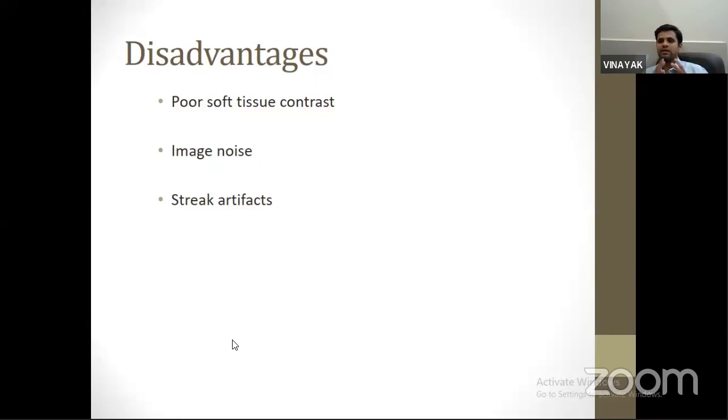But when the lesion is involving the soft tissue, like your gingiva, like your lip, like tongue, buccal mucosa, then the CBCT is of limited use. It won't give you any soft tissue contrast or soft tissue detail. So in such cases, if it is superficial, either you go for a USG or you go for an MRI or a CT scan in soft tissue mode.